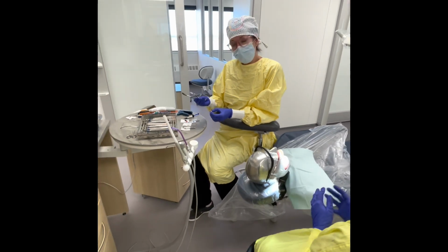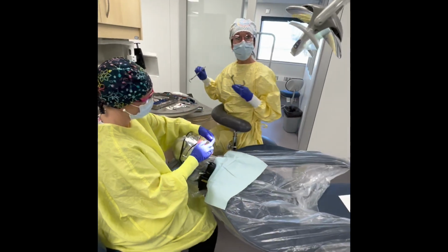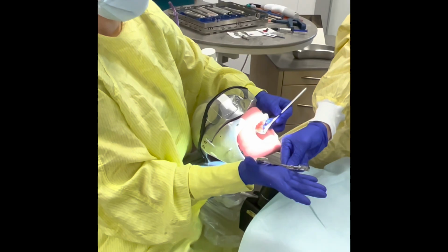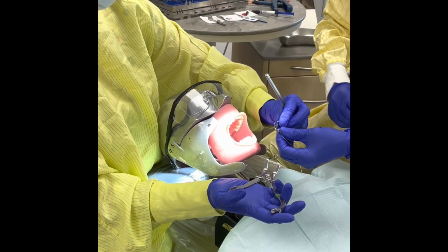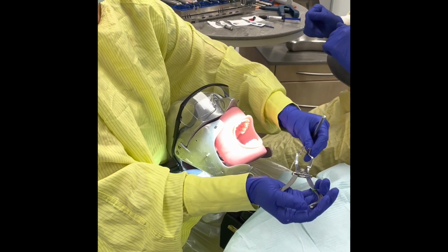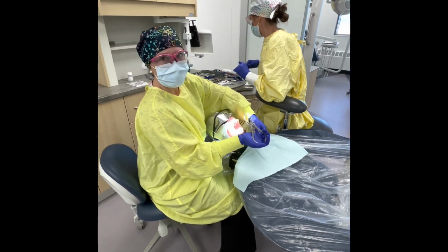So I'm going to have my forceps ready and the clamp, and of course, because we're working on the upper, she will need her mirror. So I'm going to give her that. Thank you. Then I'm going to pass the forceps, and I think she'll just grab that clamp like that and put it on the forceps herself, ensuring that we're in the transfer zone while we're doing this, okay? I have the clamp placed in the forceps with my floss around my finger.